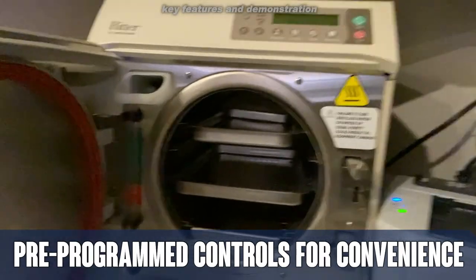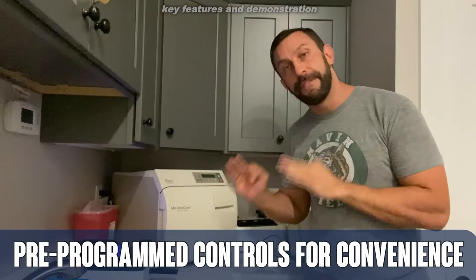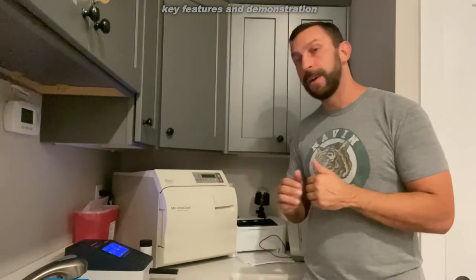This is medical grade. This is a real professional model. The M9 is absolutely fantastic, and you're going to want to pick one up today.